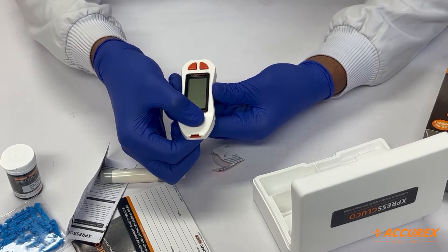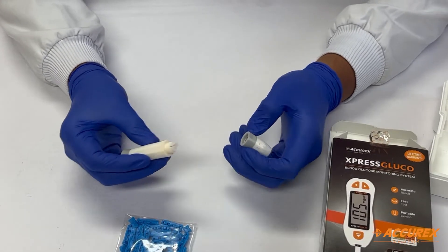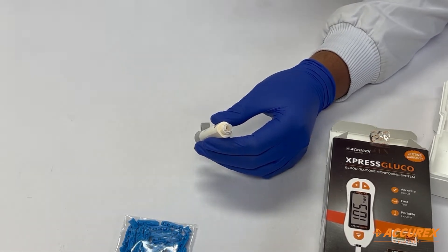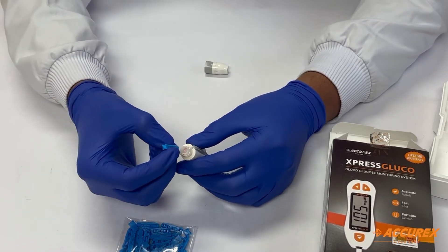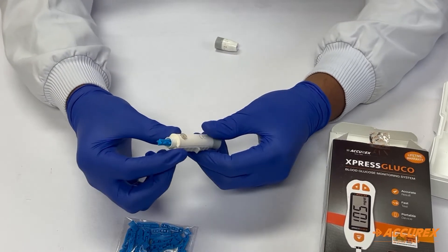For using the lancing device, you have to remove the cap of the lancing device and place a lancet in it. For placing the lancet, you have to remove the cap of the lancet as well. After placing the lancet, you will hear a click sound, which means the lancet is placed properly.